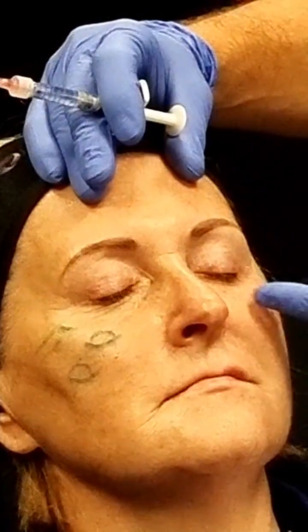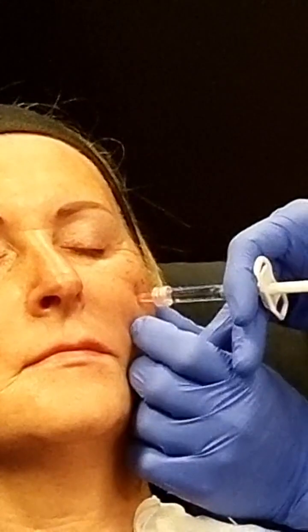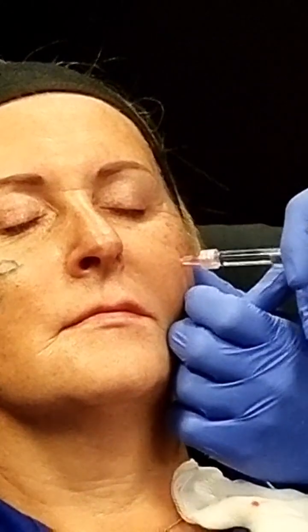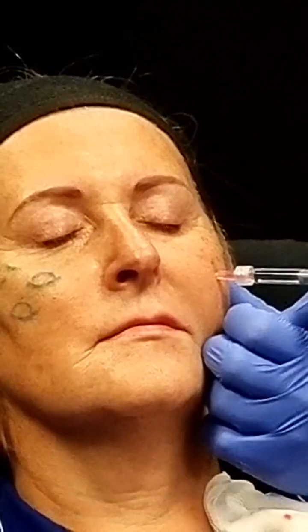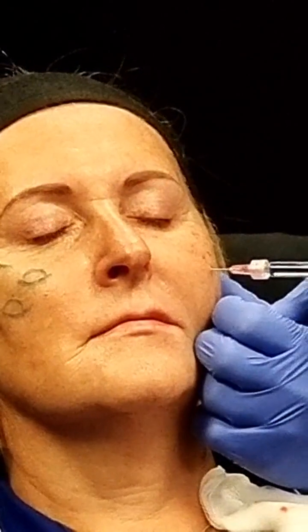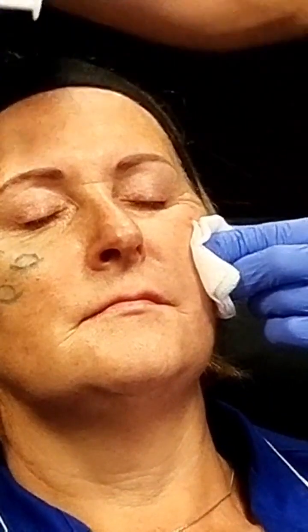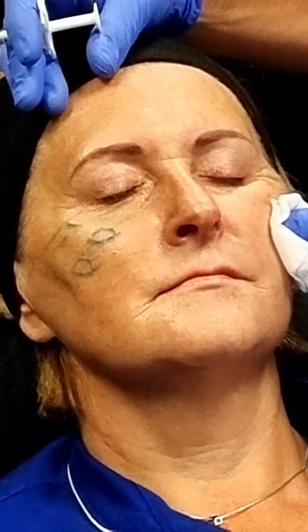Then this is McGregor's patch, what I call the golden point, just underneath, straight for the zygoma. Make sure you are in loose connective tissue. And put in 0.2. So those are the three areas of volume deficiency which I think are important to address.